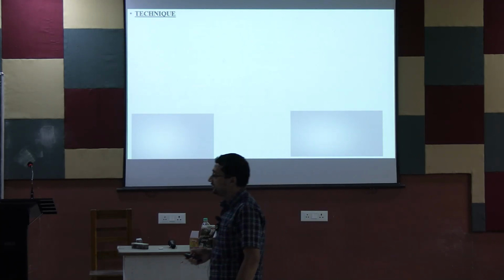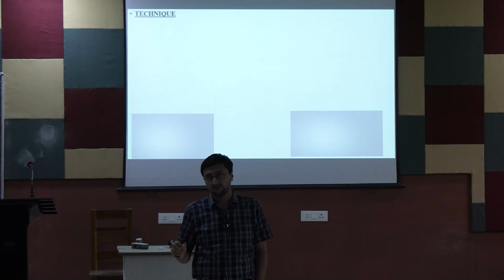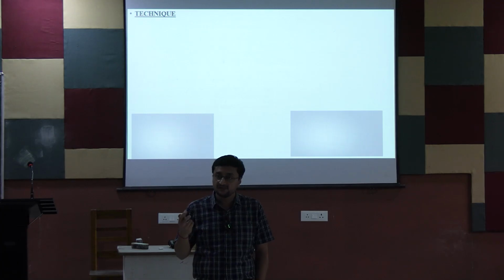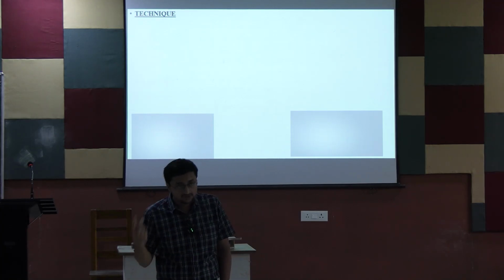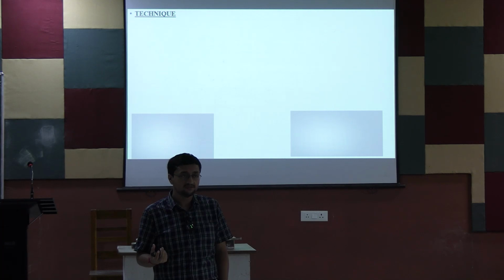Now, if the Allen test is negative, that means you can proceed. So what will be the procedure of doing an ABG? ABG কখনো কেউ করেছে দেখেছিস? What is the procedure of doing an ABG?